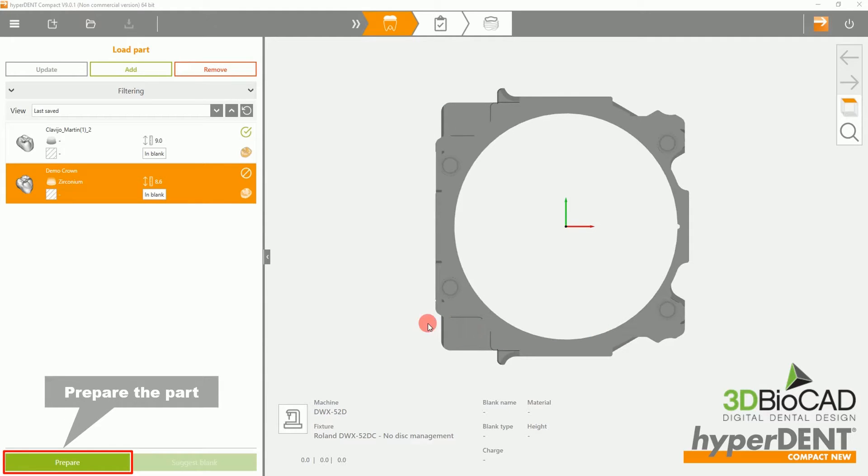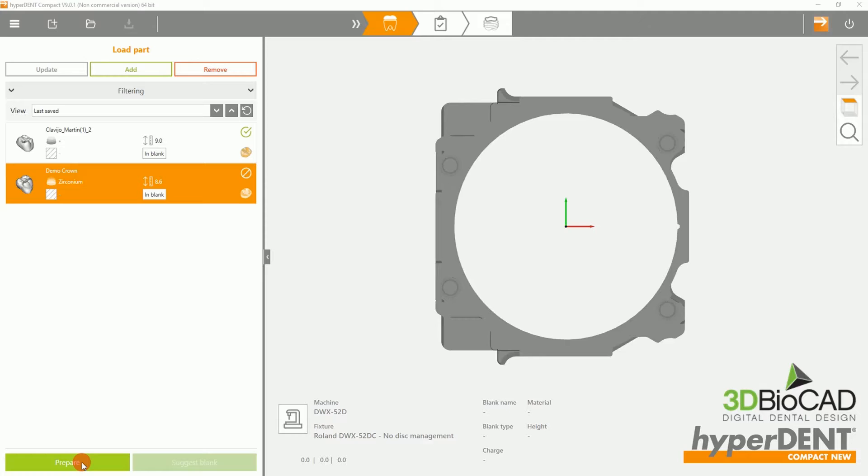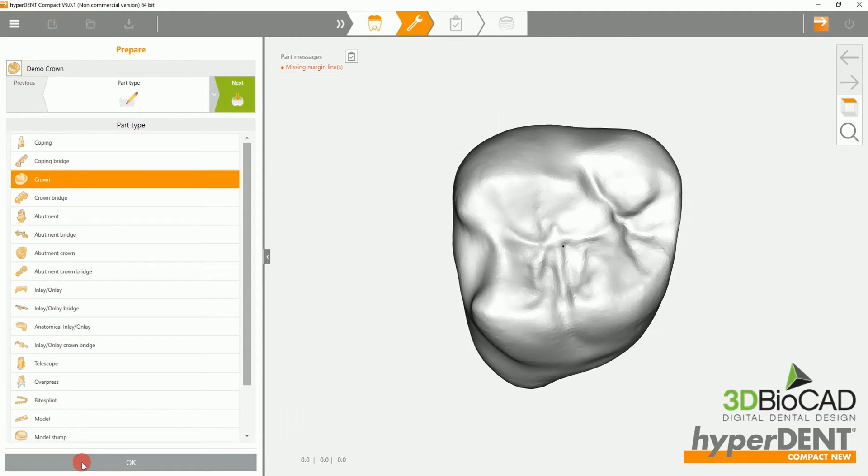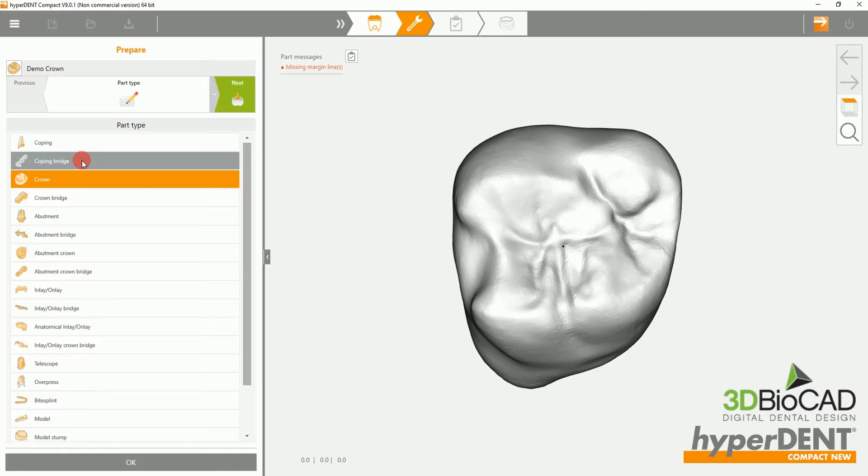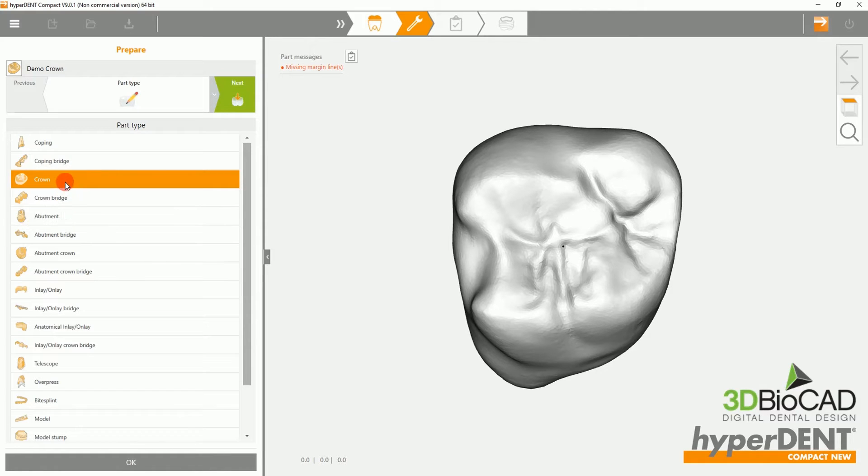Select Prepare to prepare the part. On this page, it will re-list the part types. Please use this time to double check.